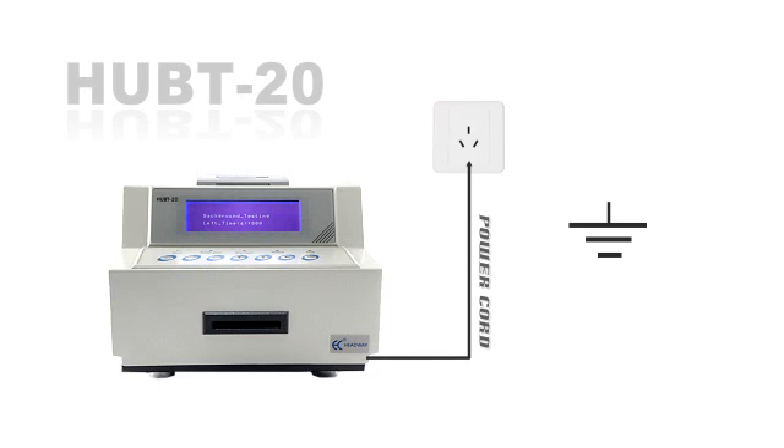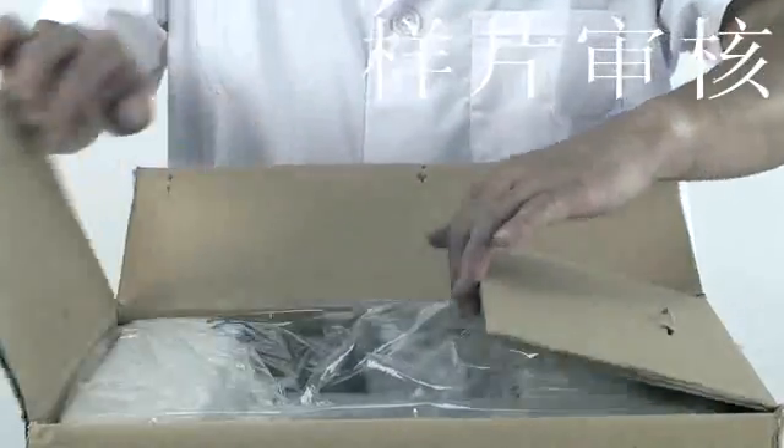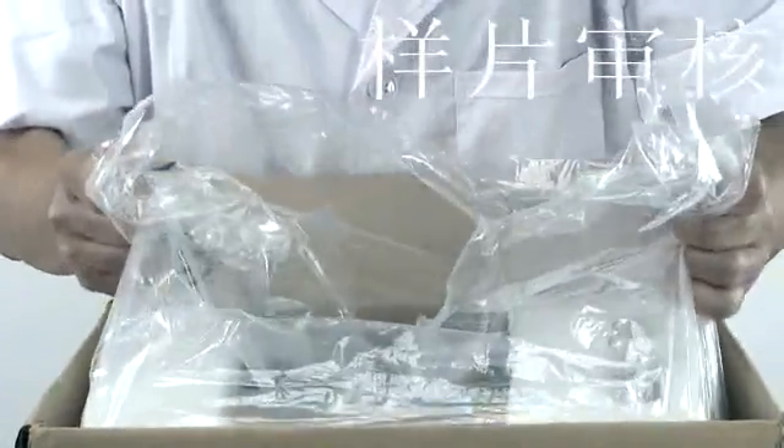The device should be connected to a safety ground and installed as far away from high-power devices as possible. Check and make sure the packing box is not damaged or upside down when you receive the device. Open the packing box and pick out the packing material and accessories.